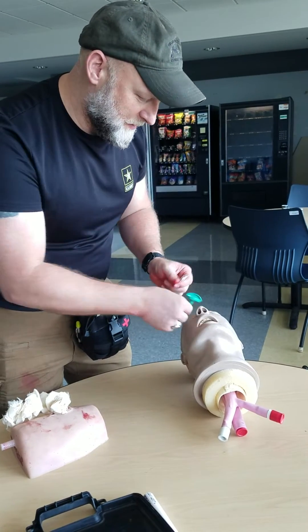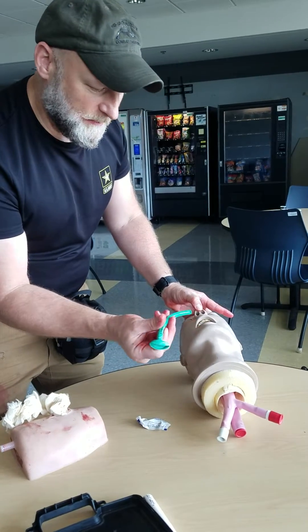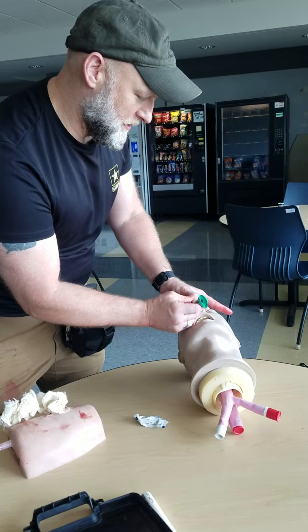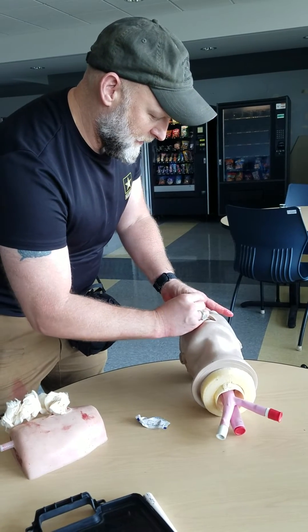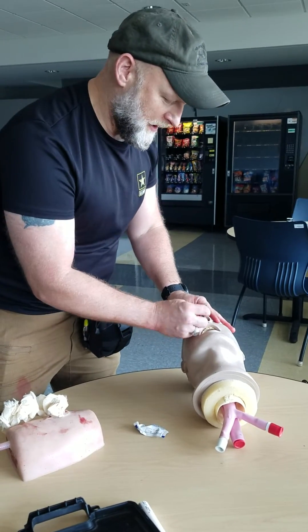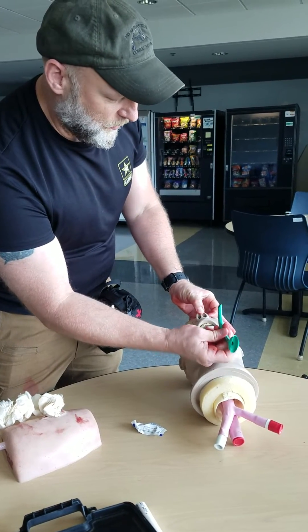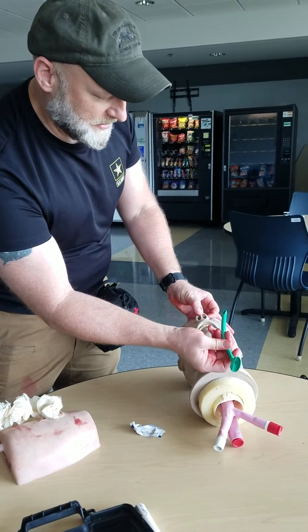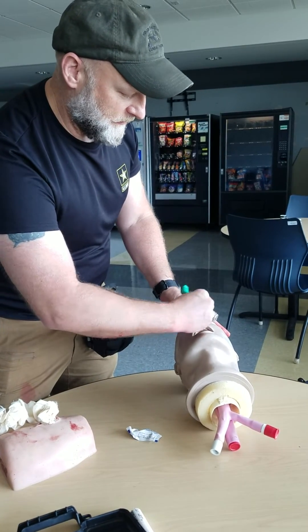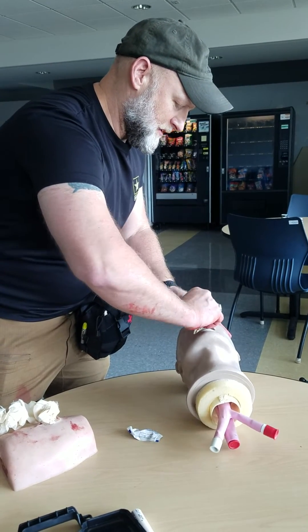I could also use spit to lubricate it. On the right side, I'm going to pig his nose, bevel towards the septum, and go in downward on the right nostril. I push it in to give an open airway that can bypass the tongue if it drops. If there's a blockage on the right side, on the left side I push it in halfway, then spin it 180 degrees to go down the rest of the way.